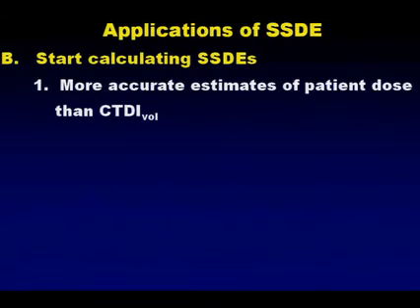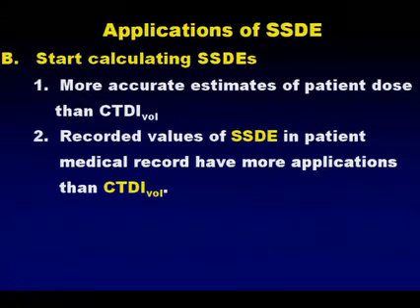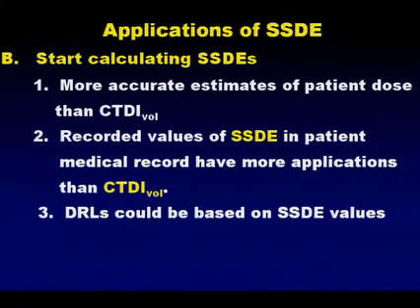We need to start calculating SSDEs. I've given you some examples of how they're more accurate estimates of patient dose than CTDI vol. I'd like to see SSDEs as opposed to CTDI vols recorded in the patient's medical record. It's a better representation of the patient dose.